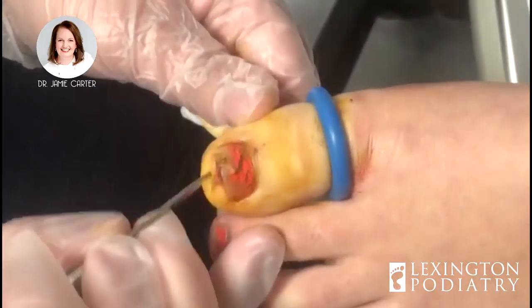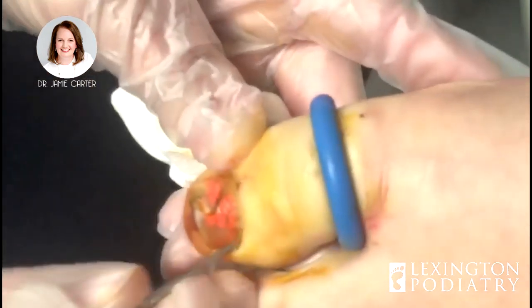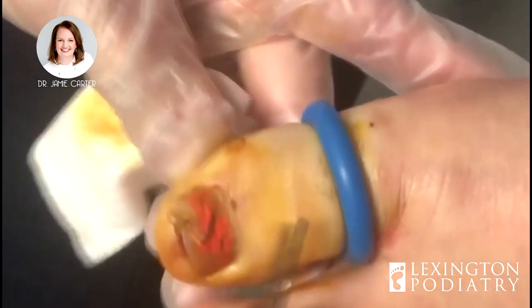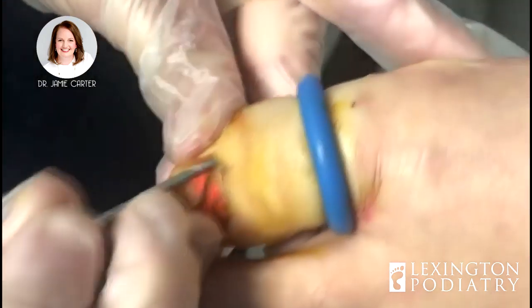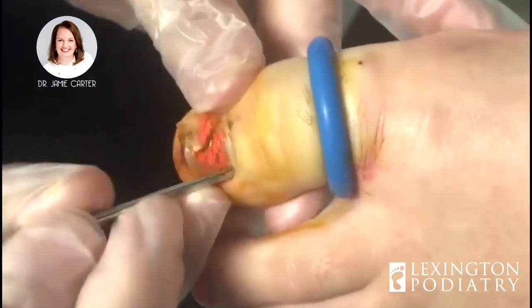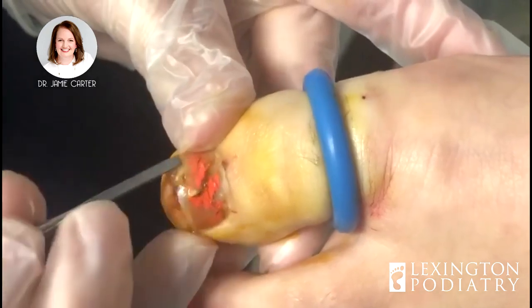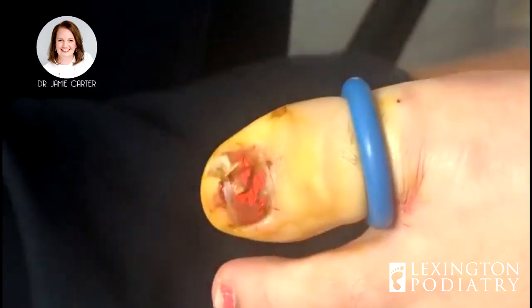She's nice and numb — we've checked her to make sure she can't feel anything sharp. So what we're going to do is loosen the skin all the way around the cuticle. When I push on it, the nail is very soft and you can see fluid coming out of it. That's a really good indicator that we should be doing this.